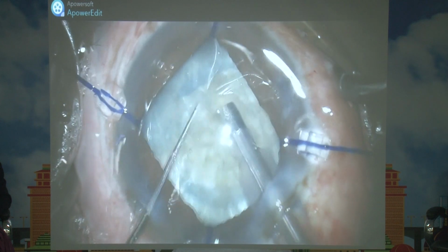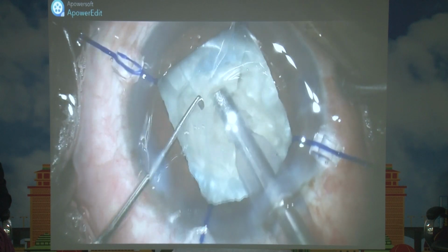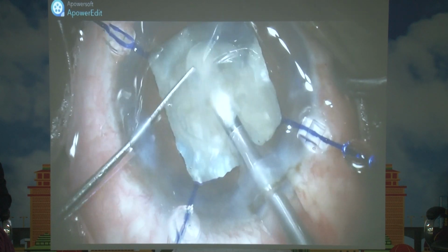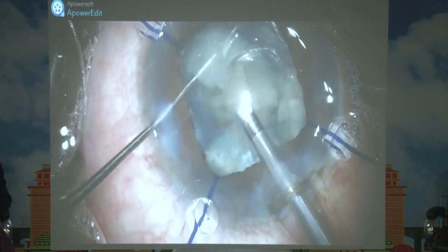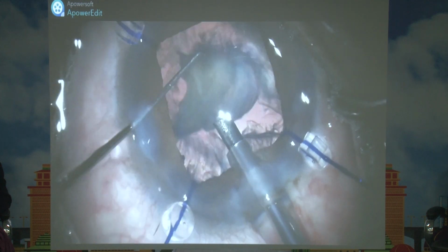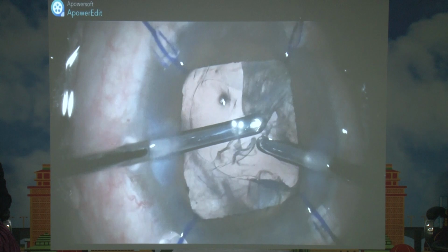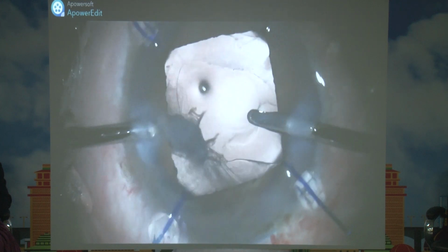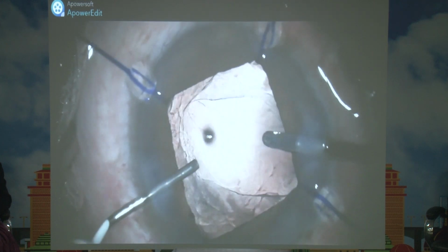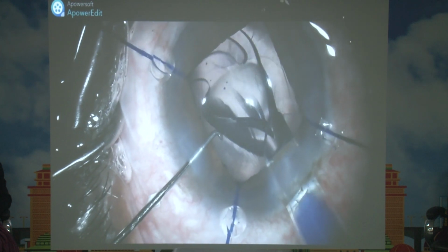Be very careful while doing the chops. It should be gentle lateral chops away from the area of the anterior capsular tear, and very, very gently, so that there is no turbulence. See, again you're putting in the viscoelastic again and again. You can see the tear now, where the iris retractor is at one side. Irrigate and aspirate the cortex in that area at the last, and be very, very careful. Here again, see, you're injecting viscoelastic before removing the irrigation. Always look for the flap motility sign.